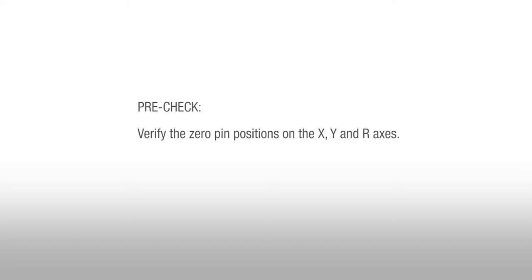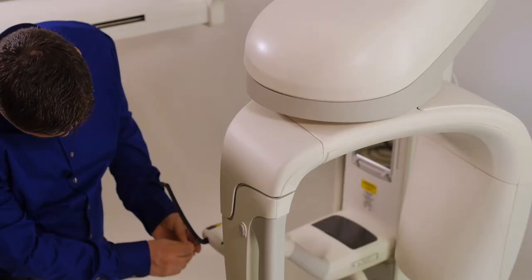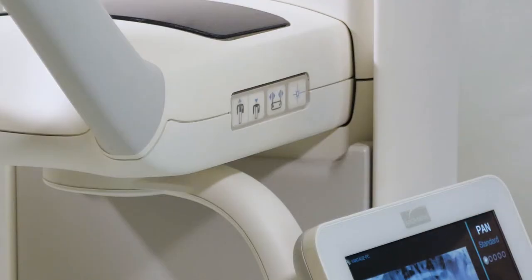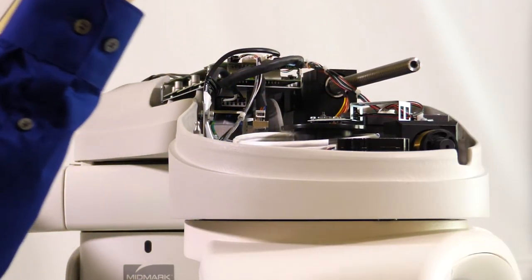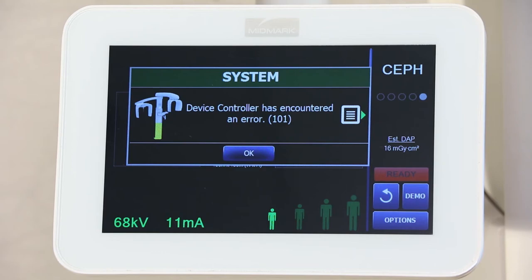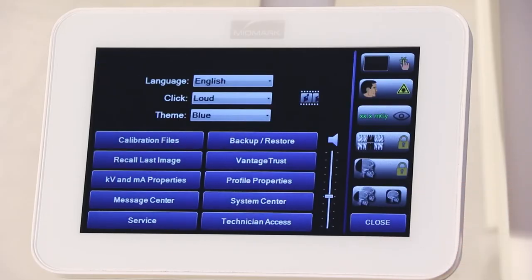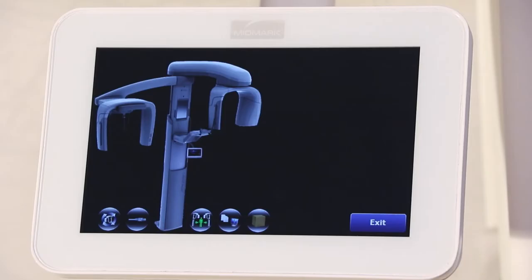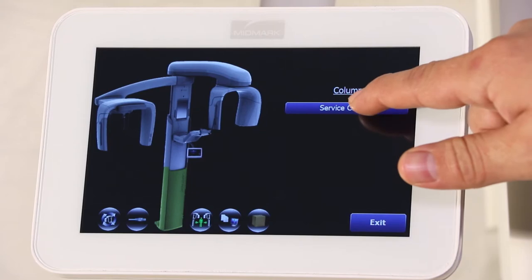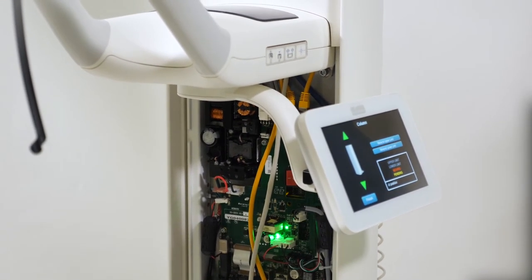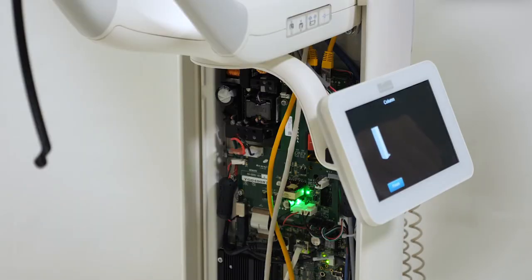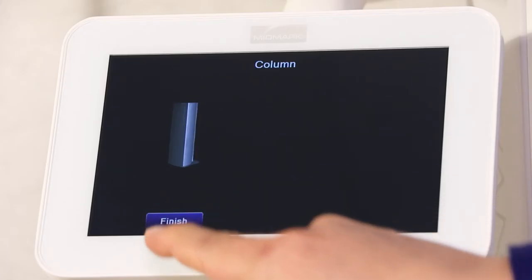To begin verifying the 0-pin positions on the X, Y, and R axes, remove the pan-bite piece, chin rest, and drop the wands to a downward position. Then use the up-down control buttons to position the unit to its lowest height, and remove the overhead arm cover. If you receive an error message when using the up-down control buttons, you will need to raise or lower the unit in service screen. Go to the service screen and select the column portion of the pan device. Then select the Service column, select Move to Lower Limit, and verify that the status text displays the Moving to Lower Limit position message. Once the unit finishes moving, select Finish twice to exit.